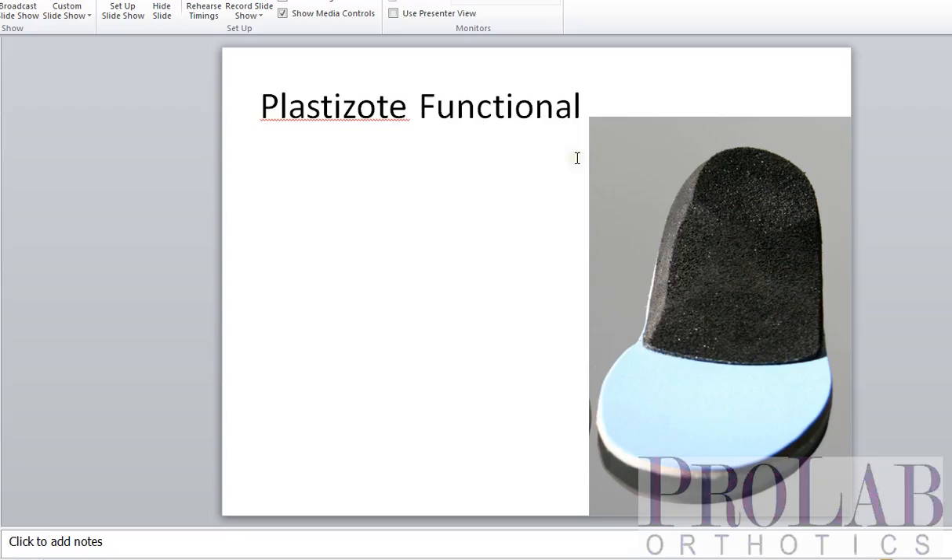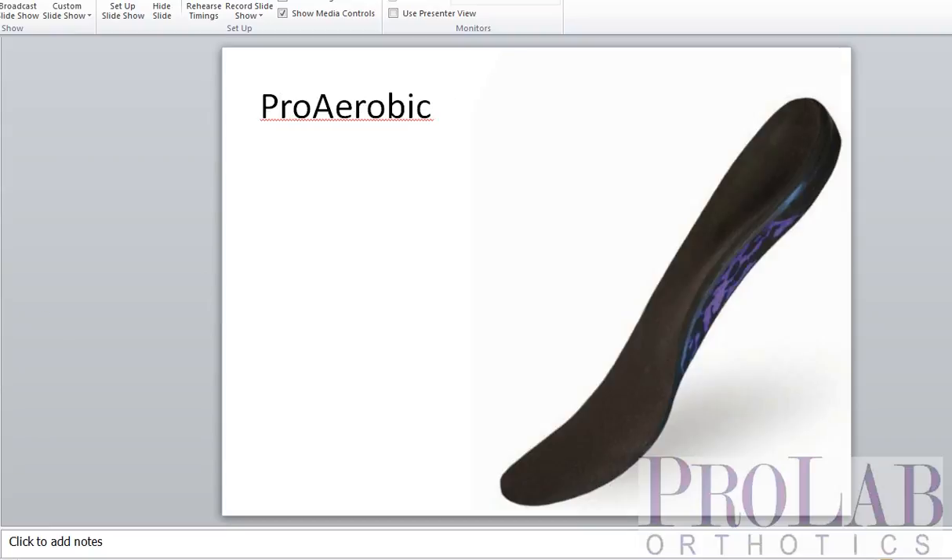Next we have the ProAerobic. This is one of our more popular devices. It has a polypropylene shell, cushioned top cover, a bottom cover, EVA fill, and an EVA rear foot post. So this is really a very elegant device — very finished. It holds up well and provides both cushioning and support.